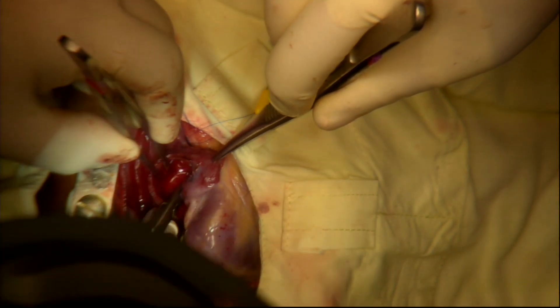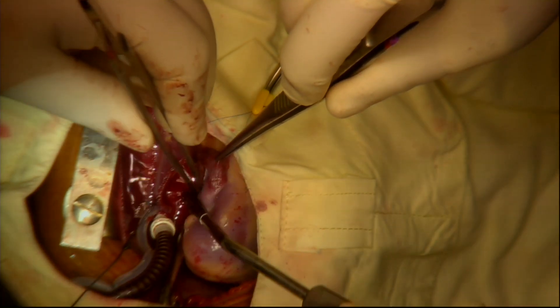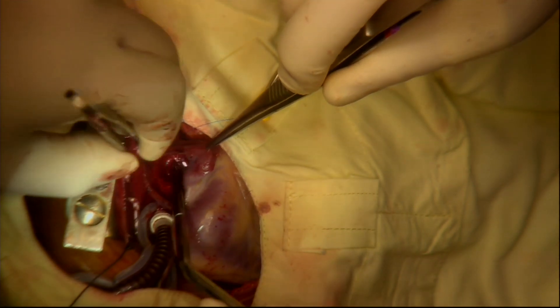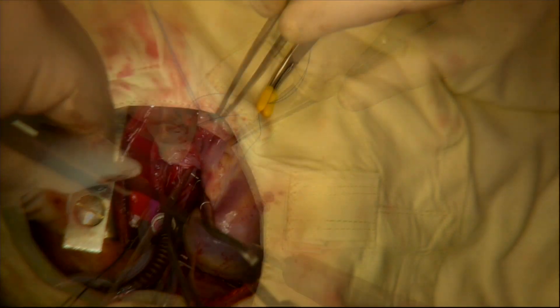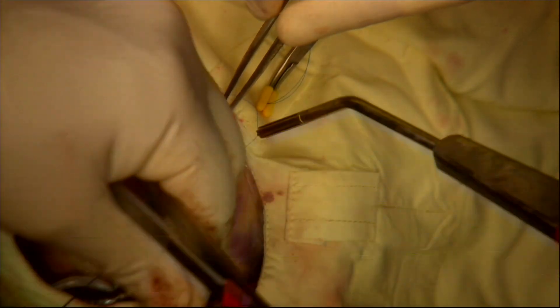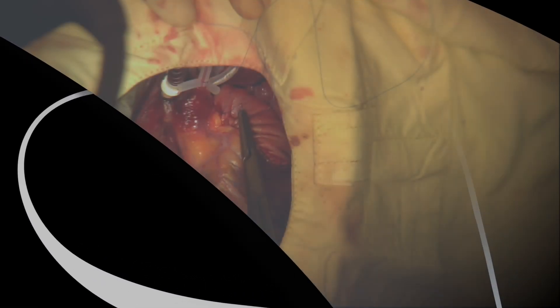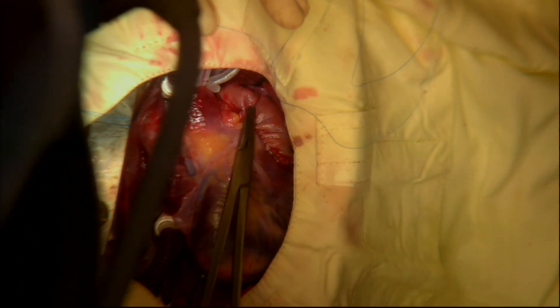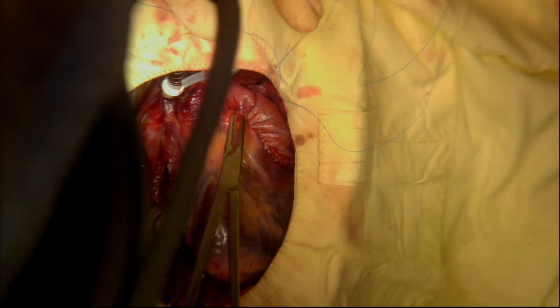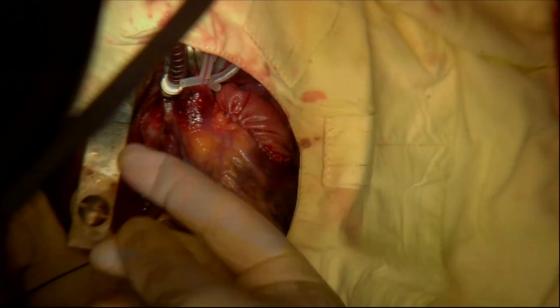A purse string suture is placed around the foramen ovale. We will later de-air the left heart through the foramen ovale, and after that we will tie the purse string, closing the foramen ovale. Both lengths of the suture are equalized, then they are secured. The suture line around the augmentation patch of the right ventricular outflow tract and the pulmonary arteries is reinforced around its circumference with multiple figure-of-eight sutures.